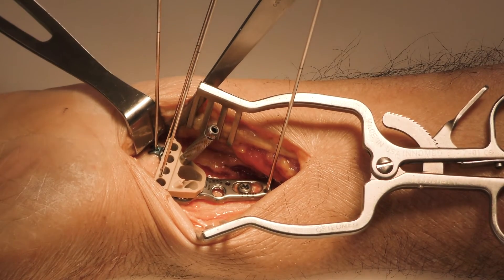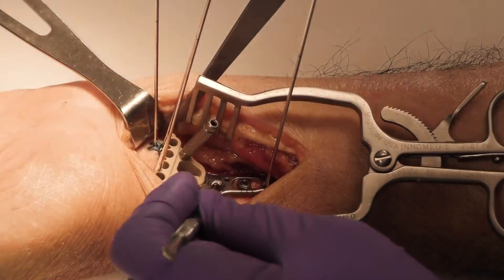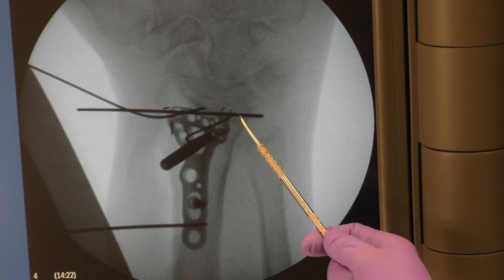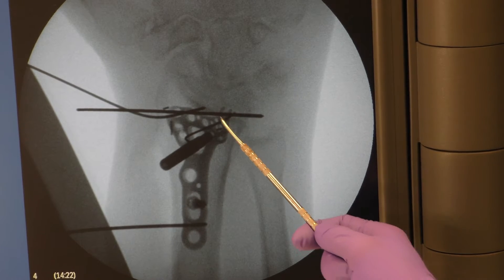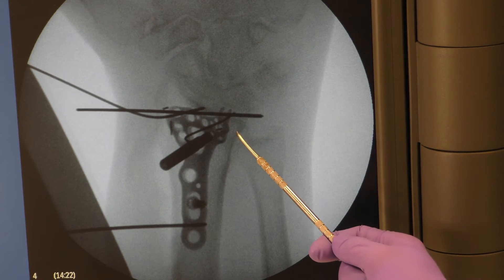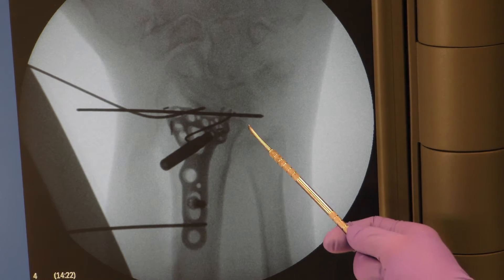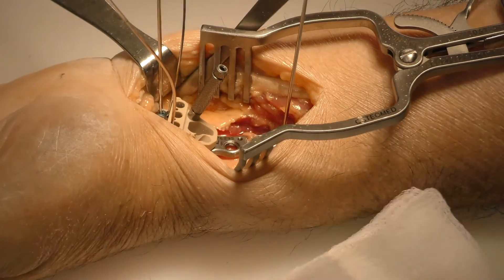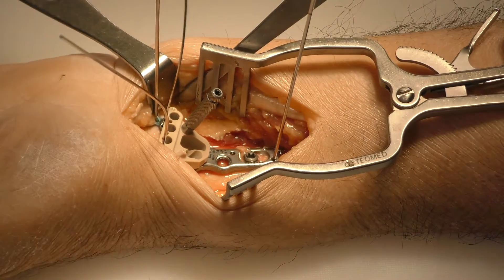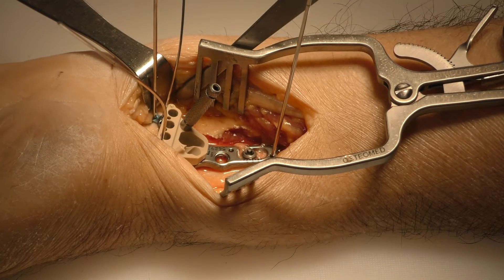At this point you have the option to continue fixing proximally, adding locking 3.5 screws to the shaft of the plate, or you can move distally. This is our intraoperative PA x-ray. You'll see here the two tines of the avulsion plate and correct position of your AccuLock 2 distal radius plate. What you want to be sure is that your tines and the ulnar aspect of the distal portion of the volar distal radius plate are outside of your DRUJ view. Once you've checked on orthogonal fluoroscopy and you like the position of your hook plate and your distal radius plate, you can fill these locking screws proximally or move distally.